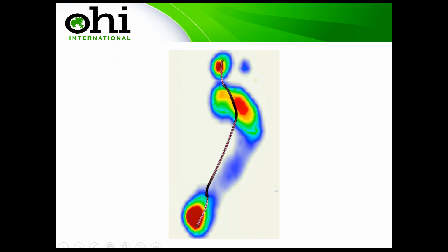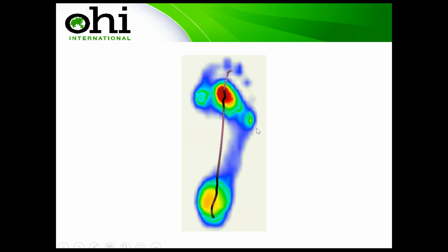So here is an example. We've got somebody who's really quick through the rear foot. We've got a little bit of slow down. We've got rotation through the knee. And then when we look at a lot of the lateral problems, they all start once we get past here, because this is the anterior compartment of the shin. This will be your tibialis anterior. It'll be your shin bone itself, your tibial stress syndrome. Once we get to here, this is all hip.